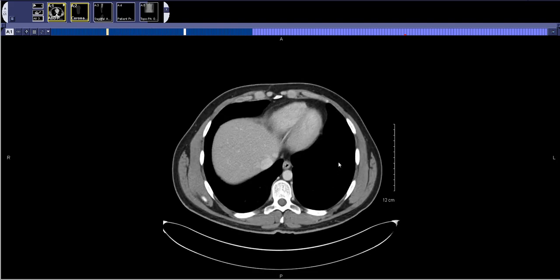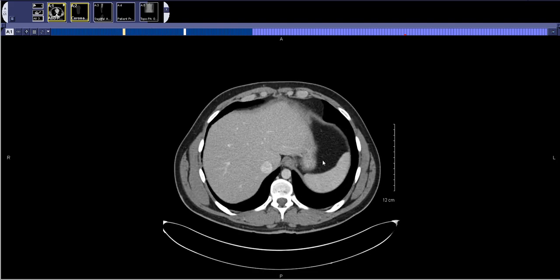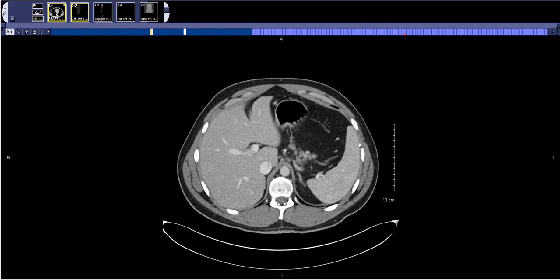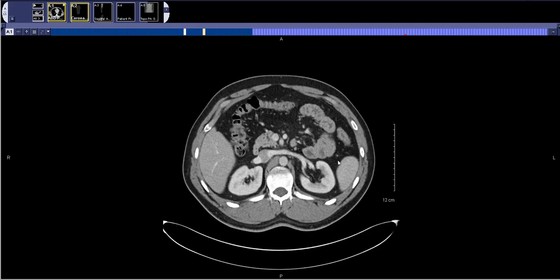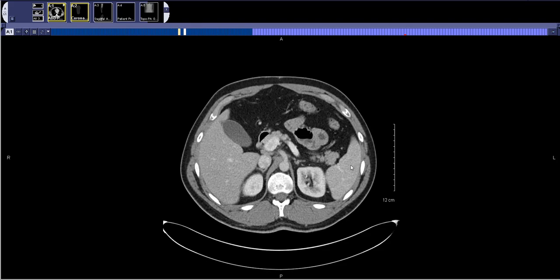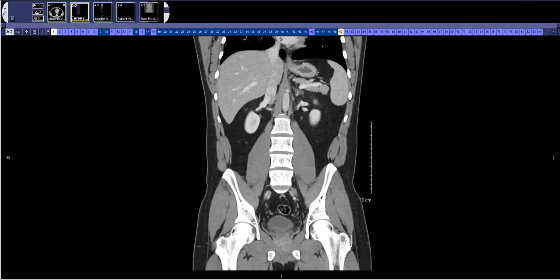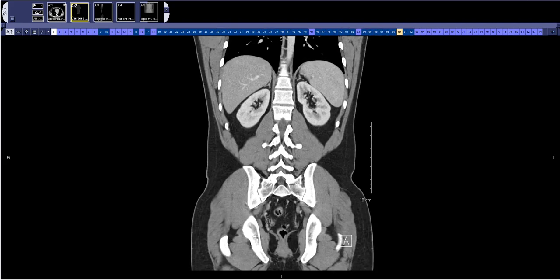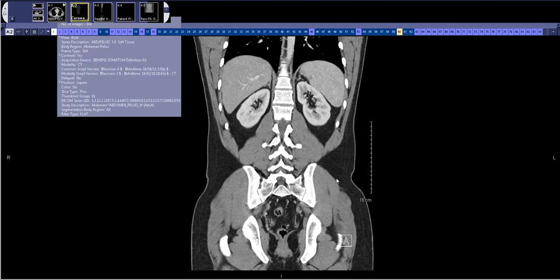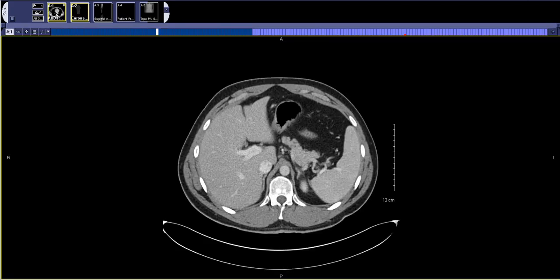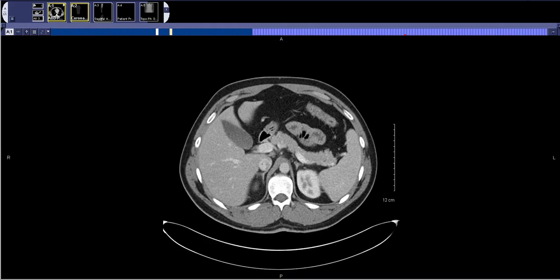Then I switch over to the spleen. I just try to determine whether it's normal in size or not. If I think it might be a little bit enlarged, I'll confirm it on coronal images. A lot of times a spleen will look big on axial but on coronal it's not big at all, so if I think it's big I just confirm it on coronals.